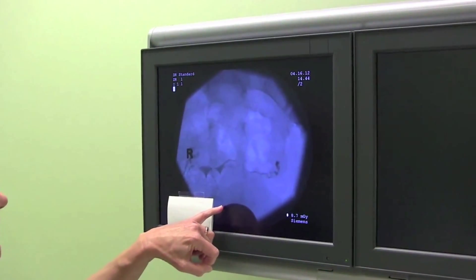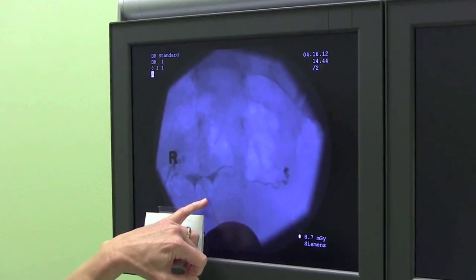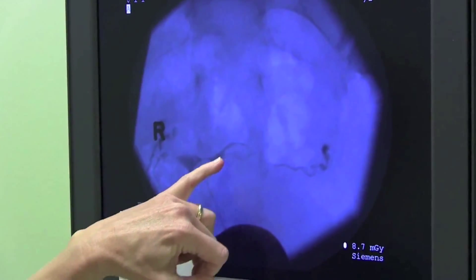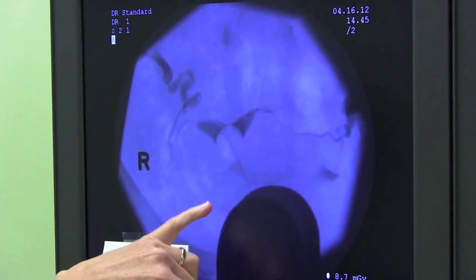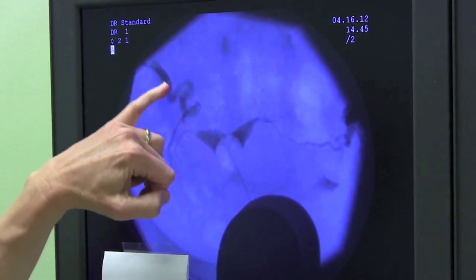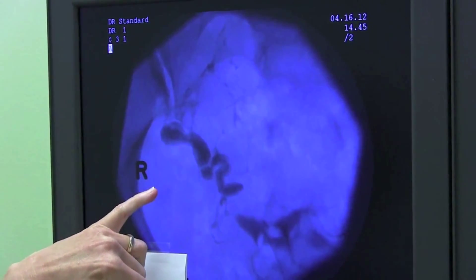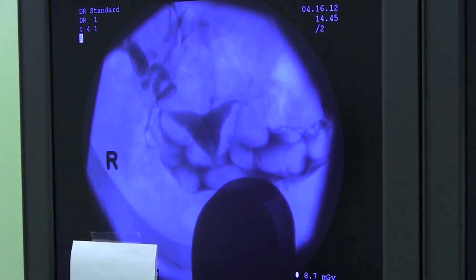This is the speculum, the catheter with the dye, and the little balloon that keeps the dye within the uterus. Here we can start to see the triangular shape of the uterus and the dye is already spilling into the tubes. On the second image the dye is seen coming out the ends of the tubes. And on our final image we've deflated the balloon and you can see a nice triangular cavity.